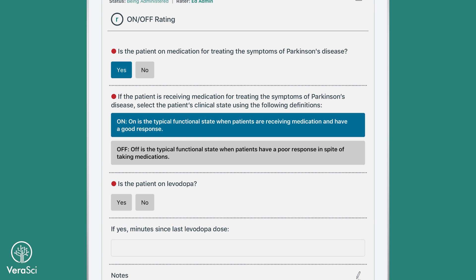If the clinician responds affirmatively that the patient is currently taking Levodopa, the tablet will automatically require the clinician to indicate the total minutes since the patient's last Levodopa dose.